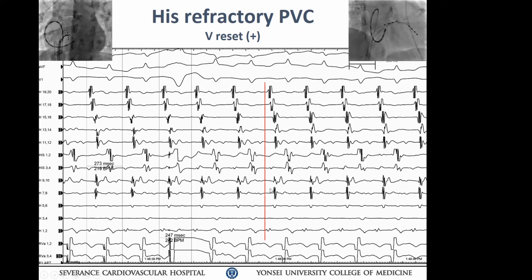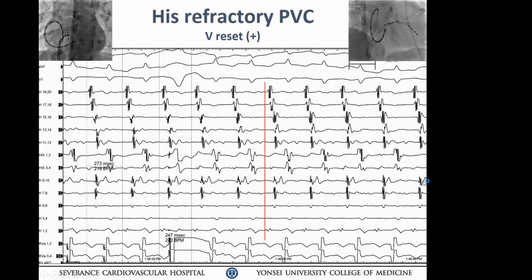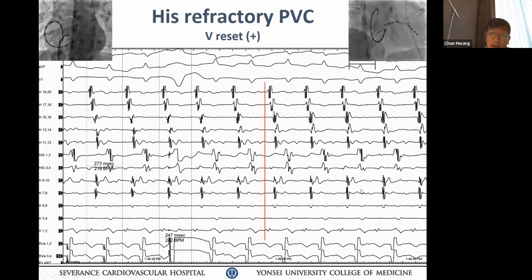정확하게 짚으셨습니다. 응? 맞아? 아니, septum 타고 올라면 히스가 빨라야지, HRA보다. 닥터박 얘기하려면은, right? 근데 left side septum이 아니고, 내가 보기엔 left side septum activation이 late here. It can be because of far away. 그 지금 히스에 보시면 far field 시그널 하나 보이잖아. 걔가 far field 시그널이 left side septum 보여주는 거거든.